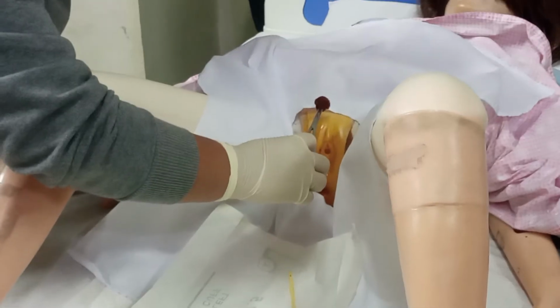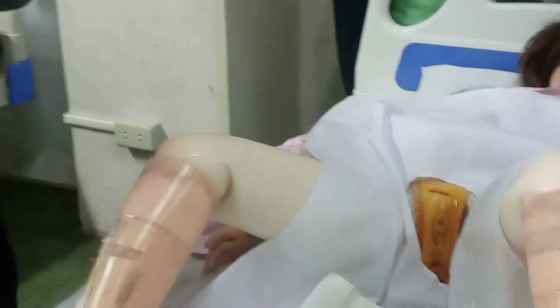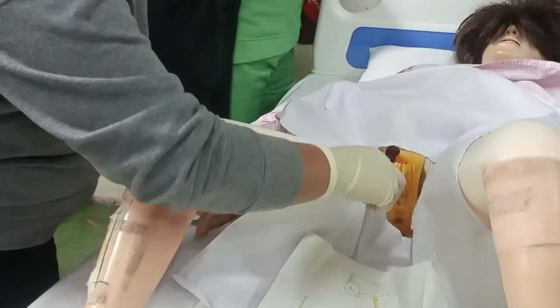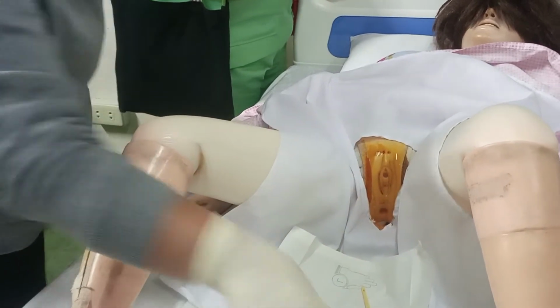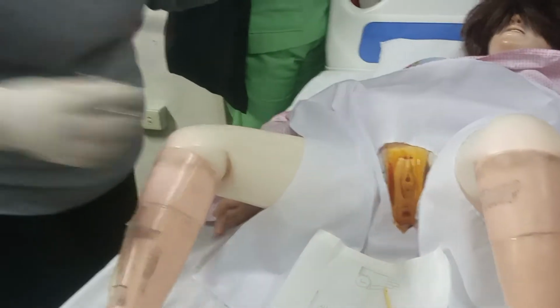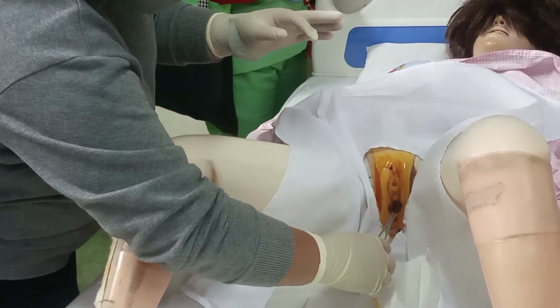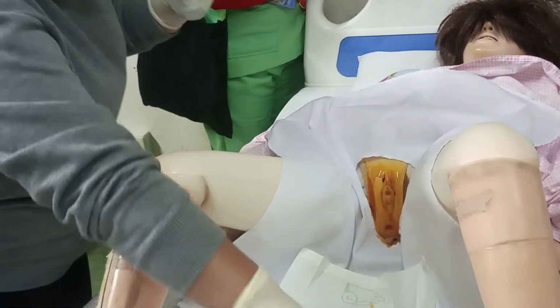I will wipe from mons pubis down to the labia majora, down to the sacrum, discard. Next, mons pubis, down to labia majora, down to the sacrum, discard. Then, mons pubis, down to labia minora, down to the perineum muscle, down to the sacrum, discard.